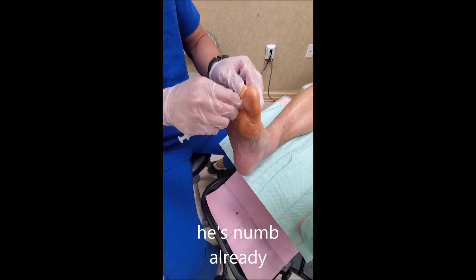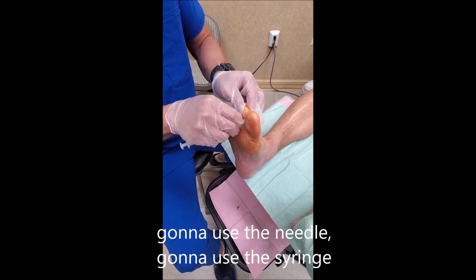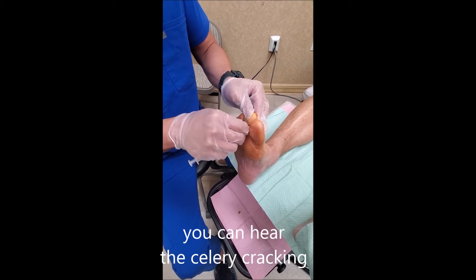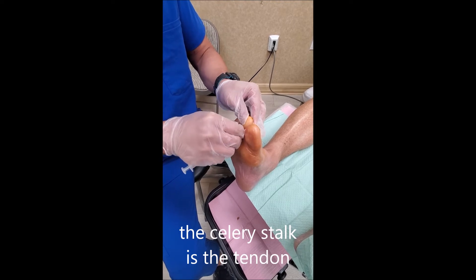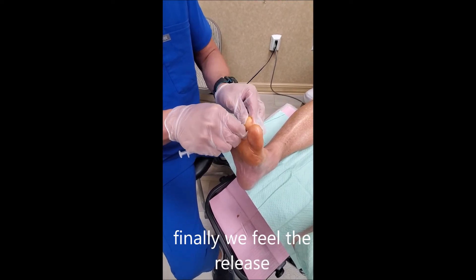He's numbed already. We're going to use the needle and the syringe, going into the tendon — you can hear the celery cracking; the celery stalk is the tendon. Now we're going to go into the joint, and finally we feel the release.